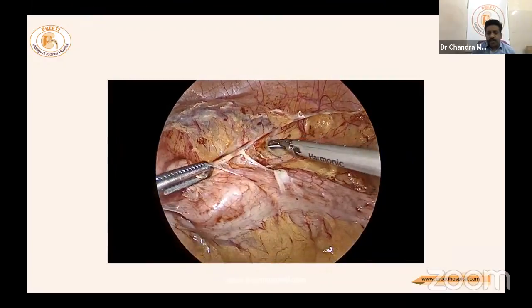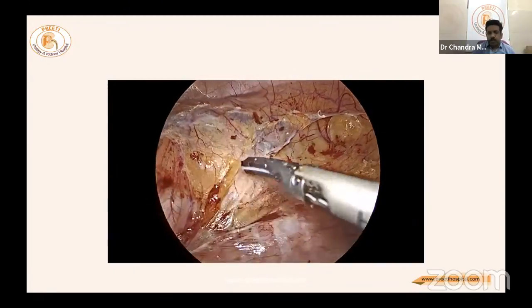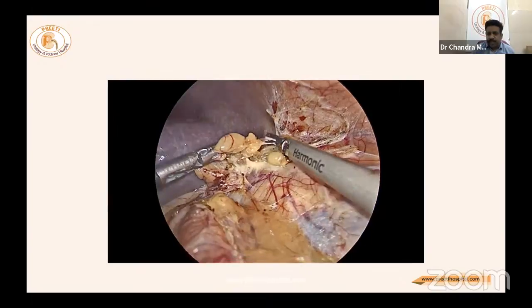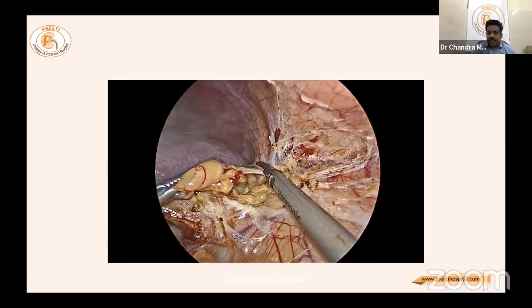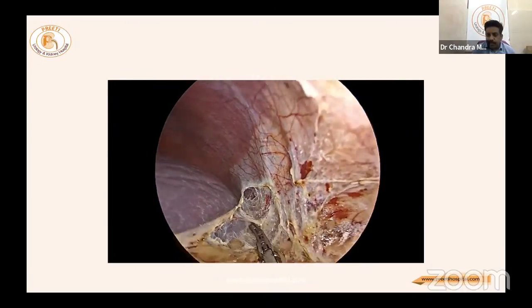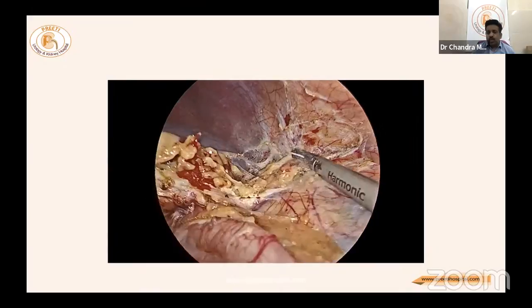Complete mobilization of the kidney is very essential in hemi nephrectomy because the hilum must be dissected completely. A key tip for juniors: in all left-sided surgeries — except pyeloplasty and ureterolithotomy — including adrenalectomy, hemi nephrectomy, and nephrectomy, identifying the plane of Gerota's fascia and staying close to the kidney is essential.